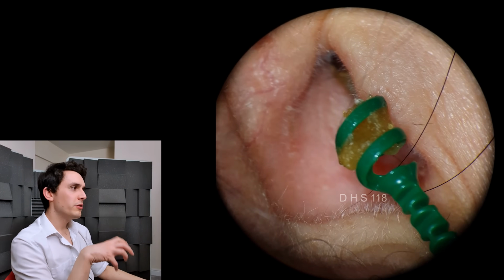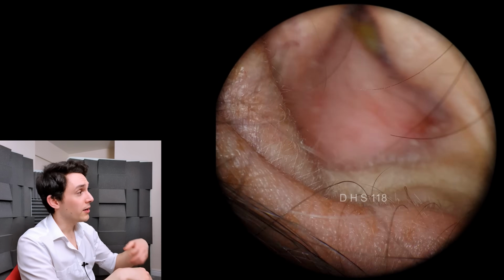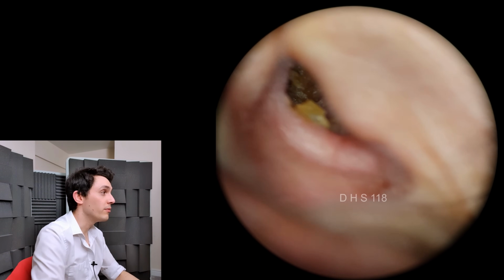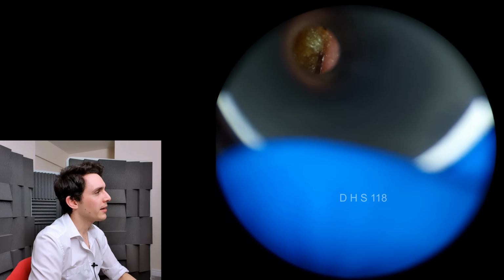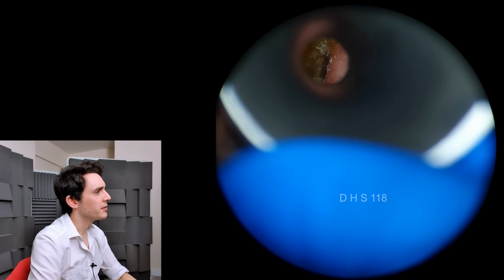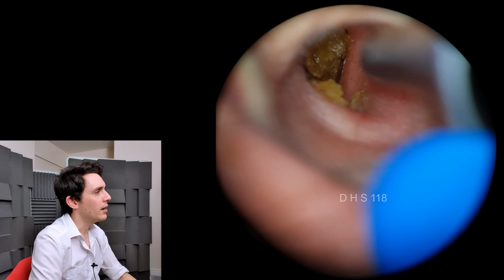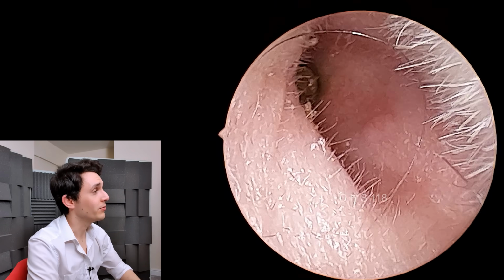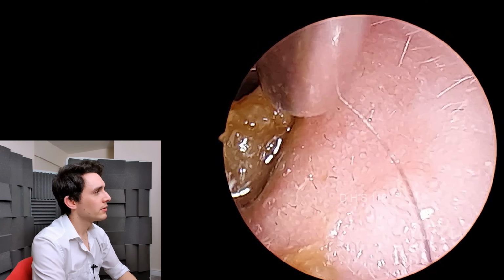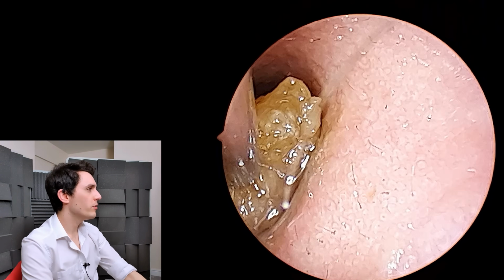So what I'm going to do now is drown the ear in olive oil, and then I'm going to go in with a standard Zollner suction probe and clear up. Just going to check it again with the speculum. There's the remaining debris. And then we're going to use an endoscope for this, so we can get the maximum amount of detail possible. So there we go. And again, the liquid and glistening stuff in there is the olive oil.